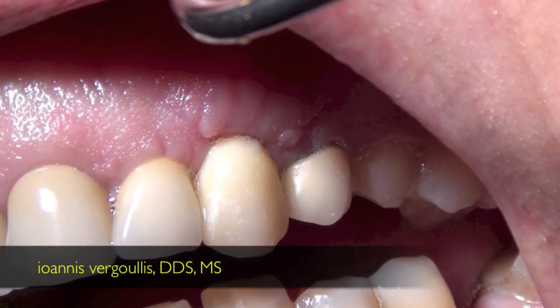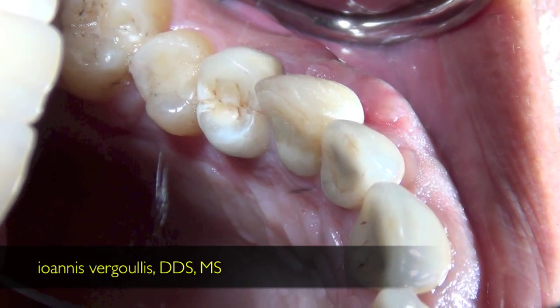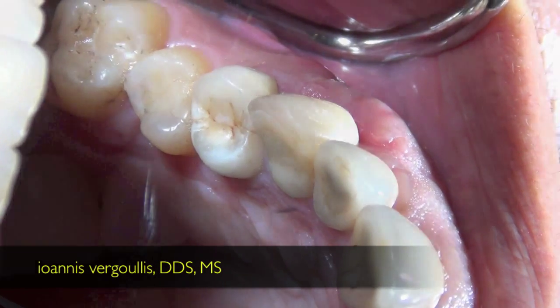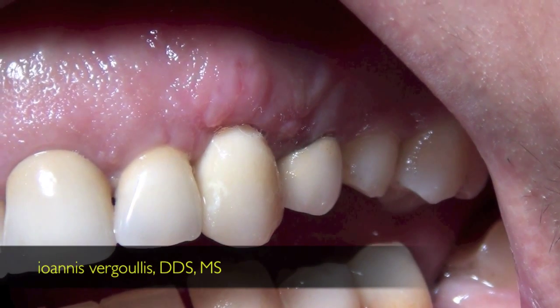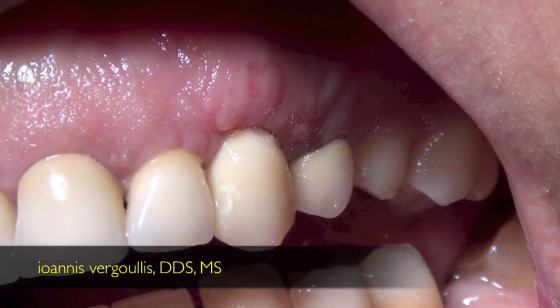One month later, you can see that we have a very nice result. We have complete root coverage, and also we were able to create a nice soft tissue profile around the temporary crown. The final crown will be placed 2 months later.